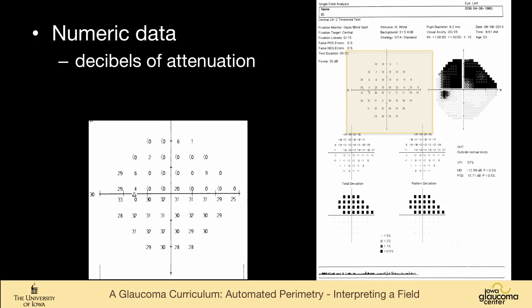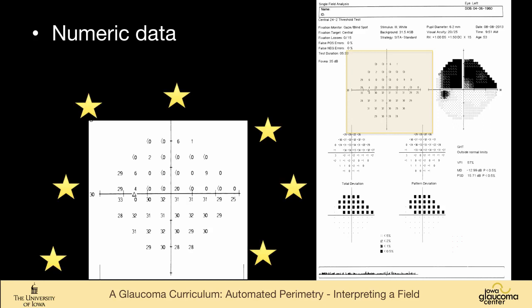Then here we can see the numeric data, and this is decibels of attenuation. So you have a very bright light, 10,000 apostilbs, and how far can you attenuate that light and still see it? And so you can see here that this point can see the unattenuated light. This point can't even see that. So this point is blind to the brightest light of the perimeter. At this point, the light can be attenuated by 30 decibels, roughly three log units, and the patient can still see it. So that's what these numbers mean. These numbers are the truth in the visual field. This is what's measured, and everything else is somewhat digested. So whenever you're confused or concerned, you should come back to the numeric data.